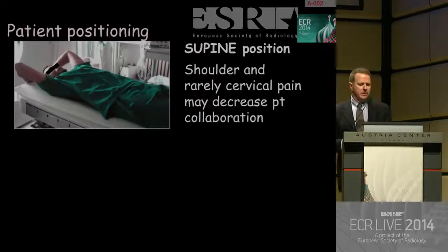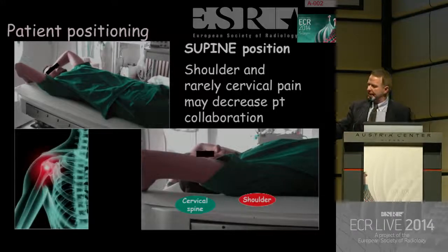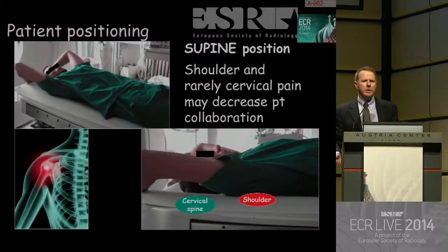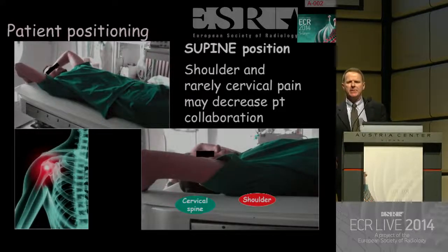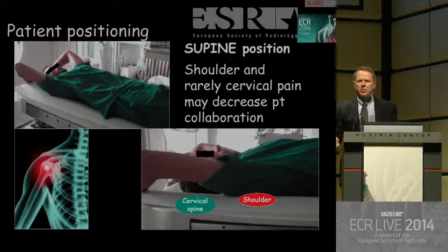Patient positioning, supine. Unfortunately, what happens is that in old people, and most of our patients are old, shoulder pain can be a problem, and cervical pain can be a problem as well. How many times have you seen a patient saying, "Doctor, I have pain in the shoulder"? No, don't move. We're just in the middle of the procedure. So you want to avoid that.